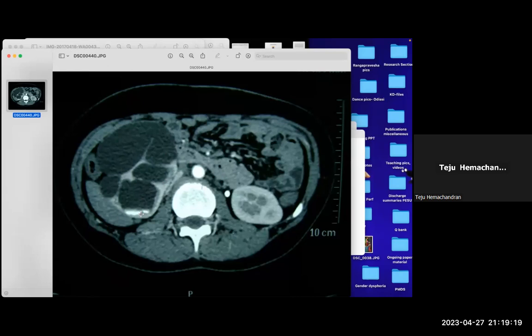Based on the age, I think it could be a congenital mesoblastic nephroma tumor, but asymptomatic. Congenital mesoblastic nephroma, do you have septae like this? Not normally. They're usually homogeneously dense masses. Okay, sir. What else can this be?